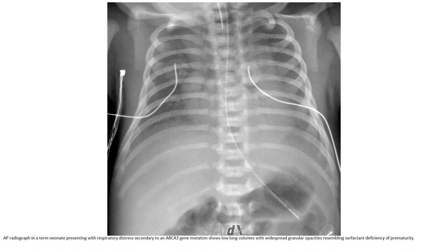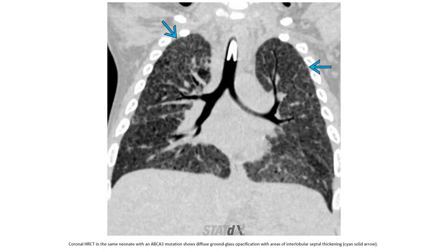Let's see the first case. This is a term neonate presenting with respiratory distress due to ABCA3 gene mutation. The chest X-ray shows low lung volume with widespread ground glass opacity resembling surfactant deficiency of prematurity. The same case on CT shows diffuse ground glass opacification with areas of interlobular septal thickening.